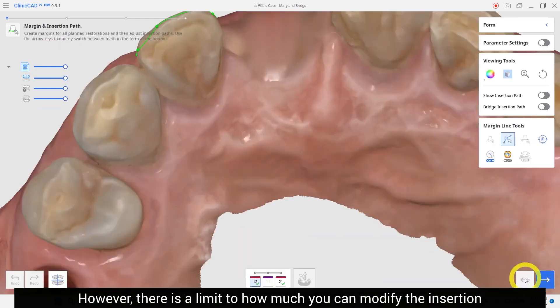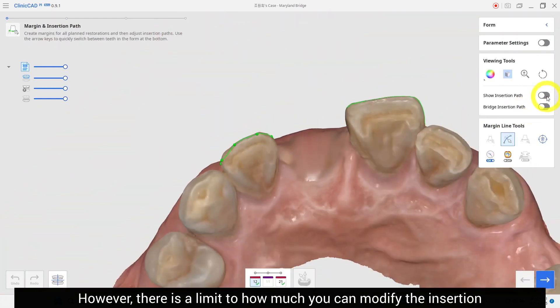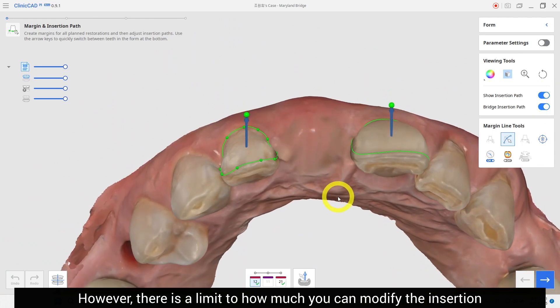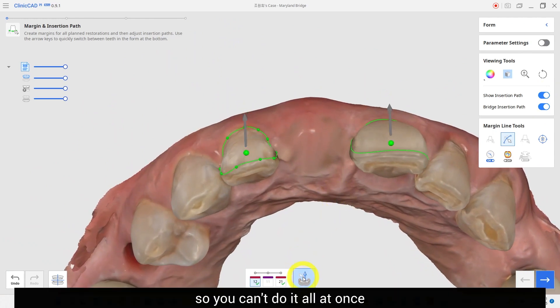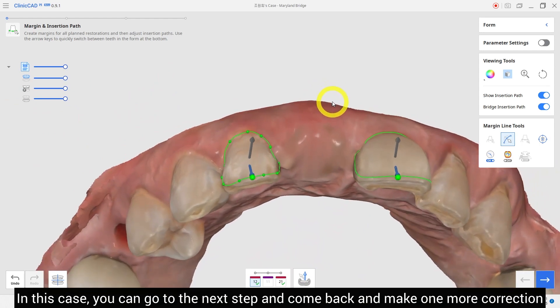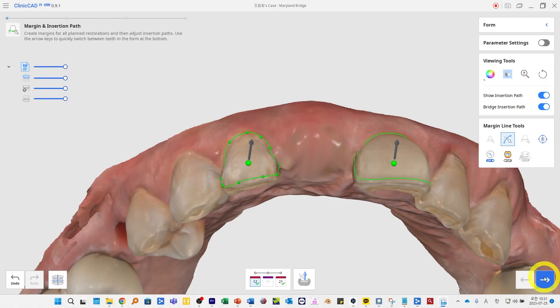The insertion direction needs to be modified to the occlusal side to some extent. However, there is a limit to how much you can modify it at once. In this case, you can go to the next step and come back to make one more correction.